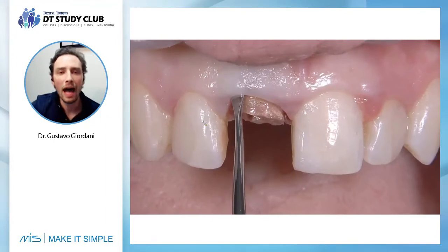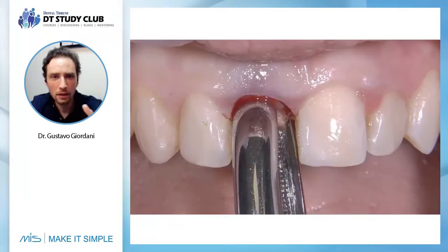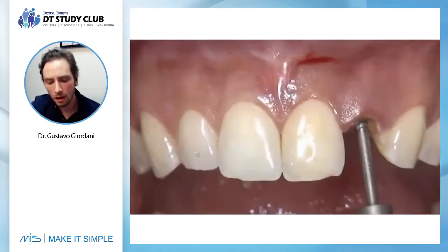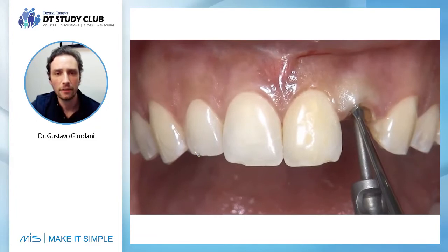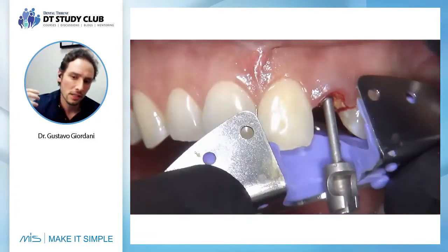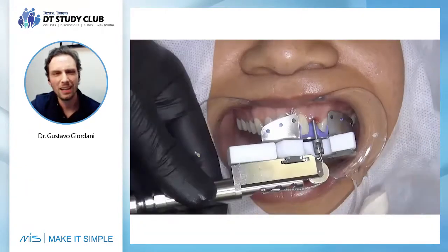Sometimes we don't have a good tooth to take and do these round movements with your forceps. There are many devices in the market to extract the tooth in a very gentle way. So we can use a Benex device, or a similar device, to extract this tooth gently.